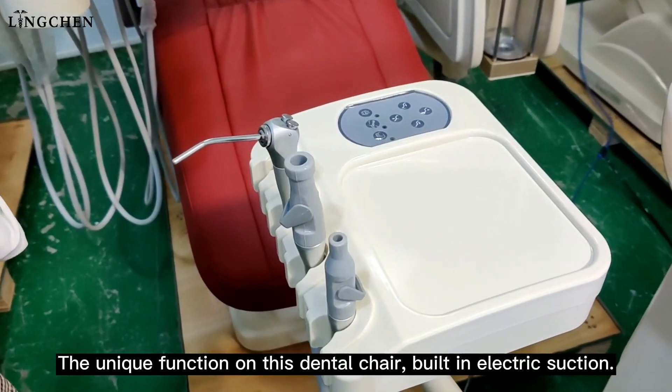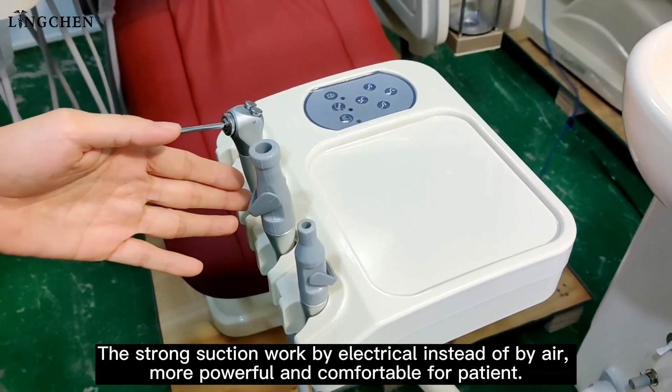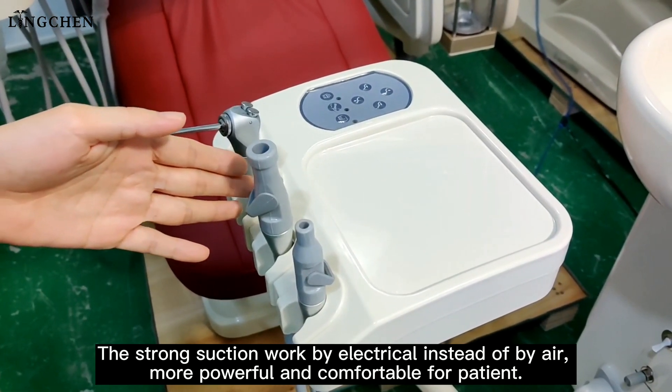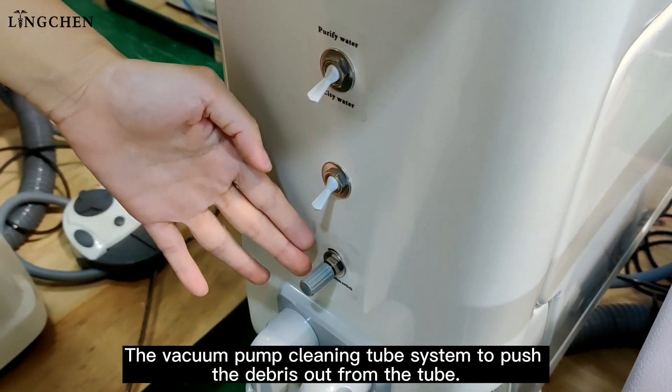A unique function on this dental chair is the built-in electric suction. The strong suction works electrically instead of by air, making it more powerful and comfortable for patients. There is also a vacuum cleaning tube system to push debris out from the tube.